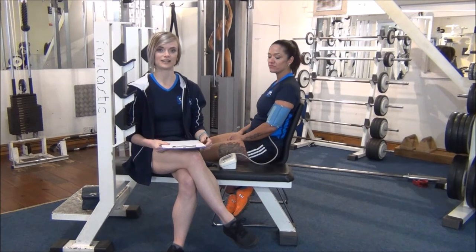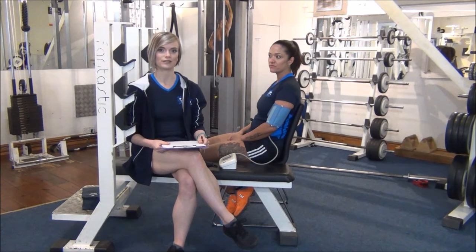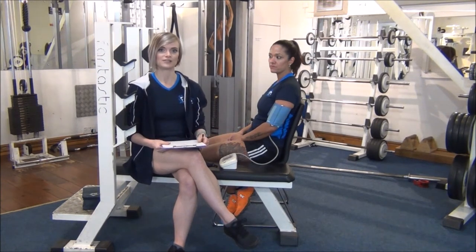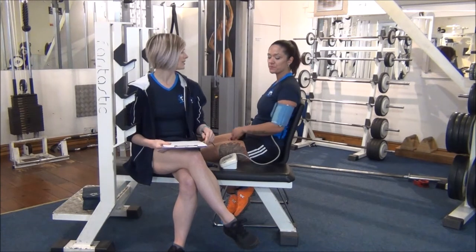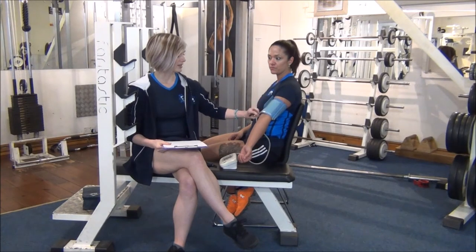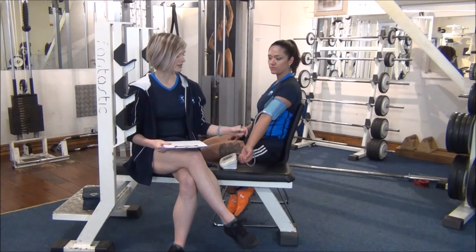Okay everyone, the next test today is another static test. It's a blood pressure test along with the resting heart rate. To take all the guesswork out, we've got an automatic machine. You need to make sure that you put the cuff on the left arm of the client, because the tube runs down where the main vein is in the forearm.